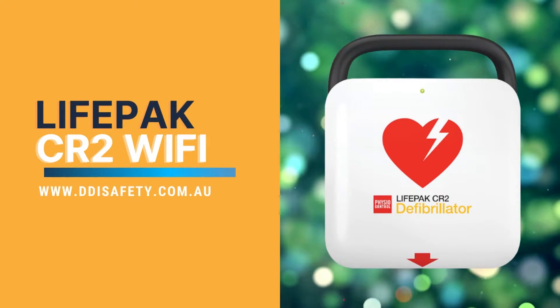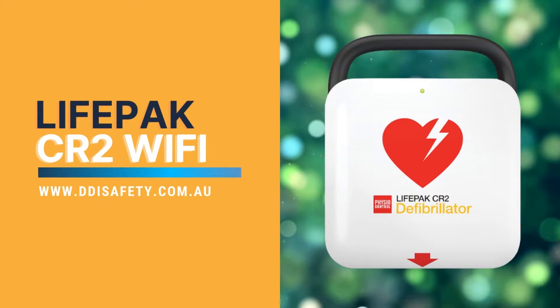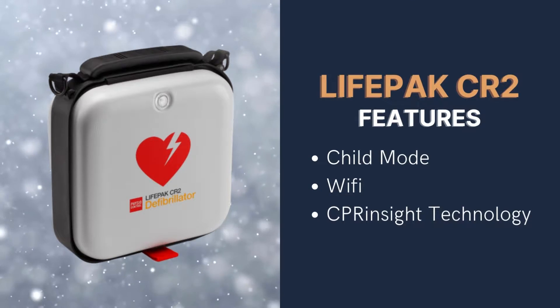Time to get a defibrillator? Why consider the LifePack CR2 Wi-Fi models? For three important reasons: child mode, Wi-Fi connectivity, and CPR insight technology.